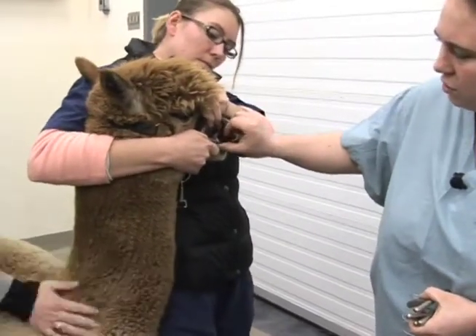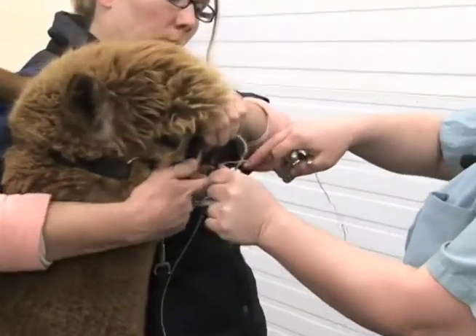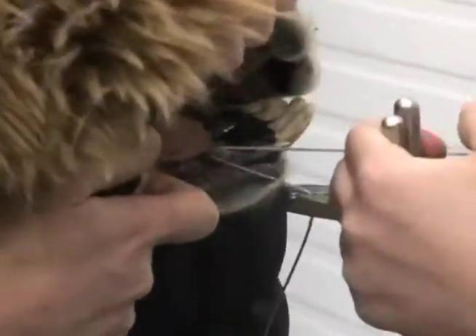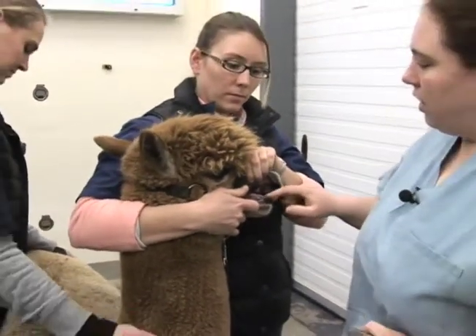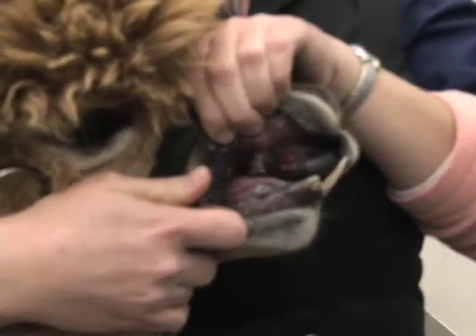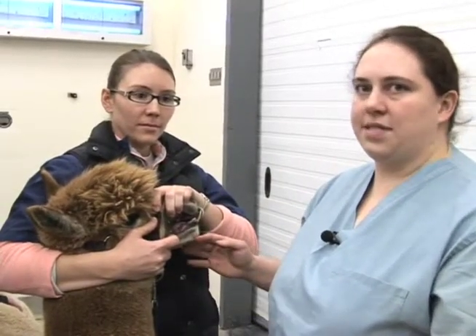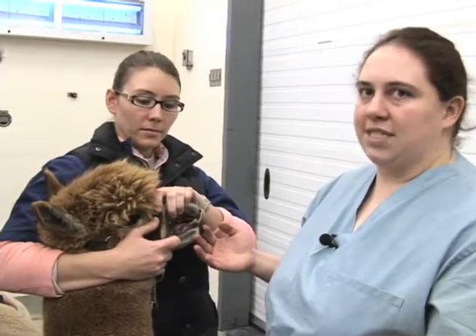Sometimes you'll have a little residual attachment but usually you've got enough of it that you can easily pluck that piece out. Then the last one we'll do is on the bottom jaw. A lot of times the animal will actually resist and pull back, and that's okay — it actually makes your job a little bit easier. You can see that these are all down. We do have just a little bit of bleeding at the gum line; that's not uncommon and this small amount will resolve on its own over the next couple of minutes. After you've removed all of the fighting teeth on this side of the mouth, you use the same procedure to remove the teeth on the opposite side. You may have one or two or potentially all three on each side for a total of six teeth that need to be removed.